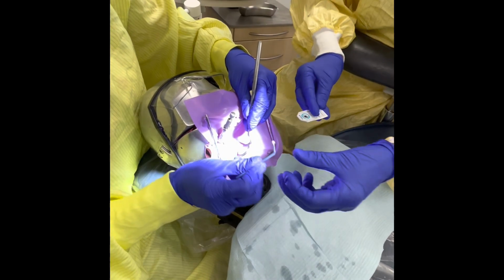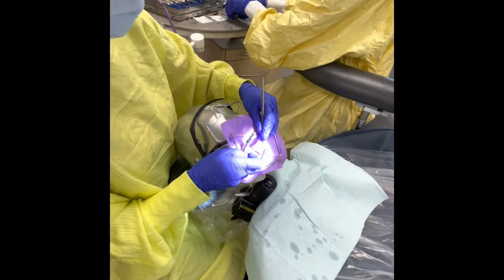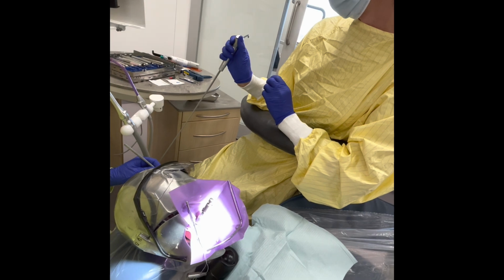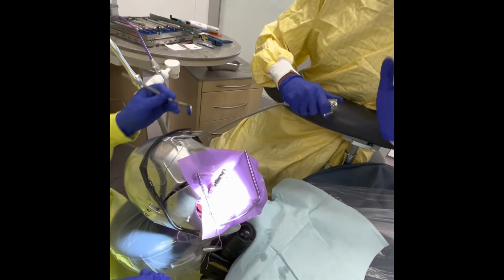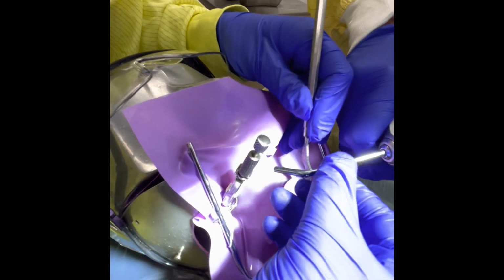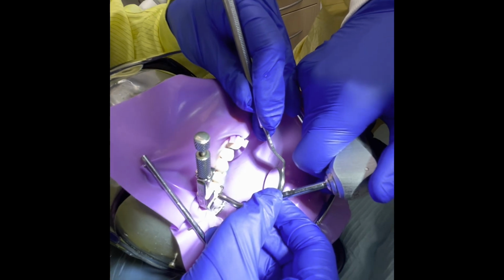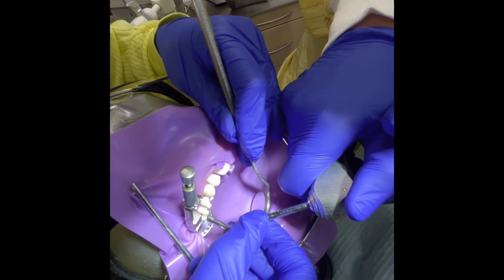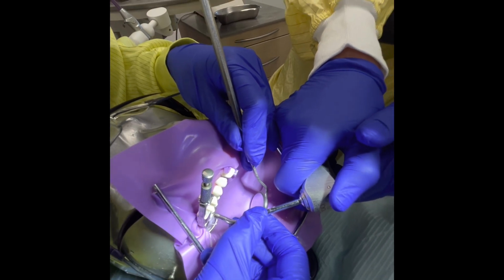And that is 20 seconds. Thank you. Now I'm going to air dry for 5 seconds. Again, I'm going to give my air water syringe a couple little puffs with that air so I know it's air that's coming out. Amanda will guide me in. And we're going to go 1, 2, 3, 4, and 5.